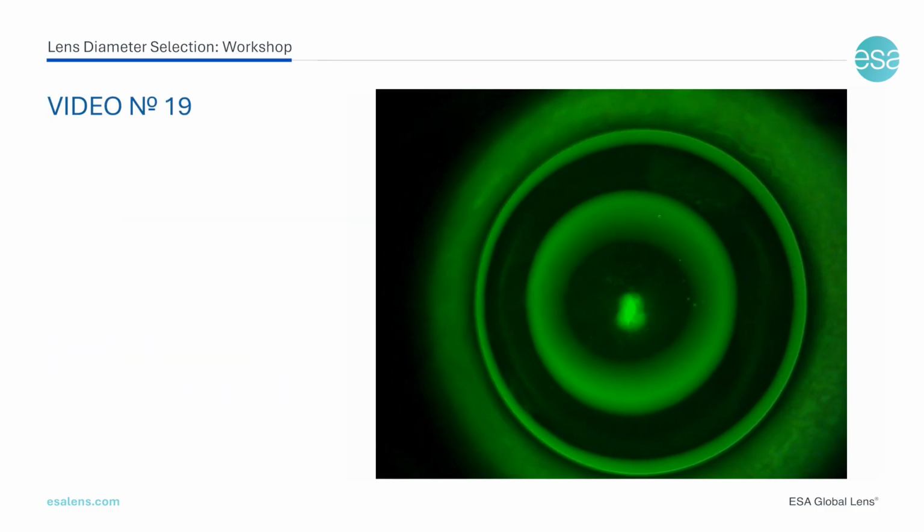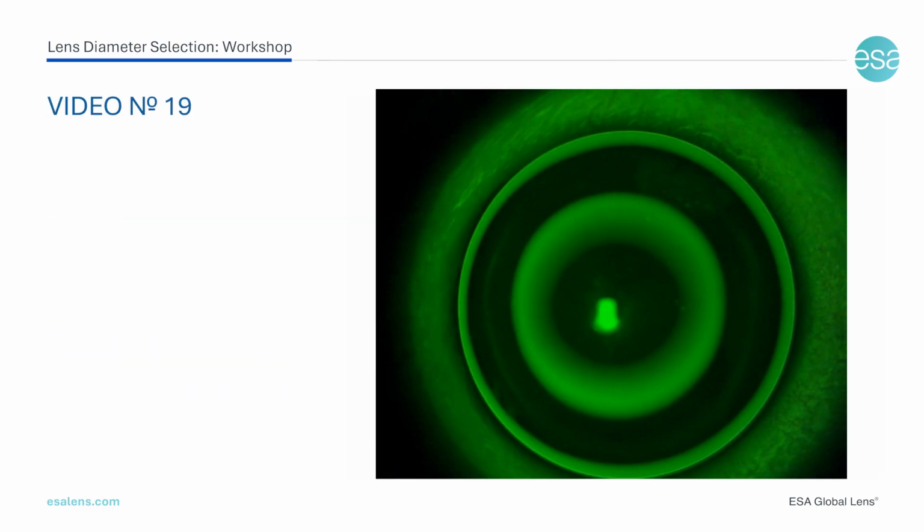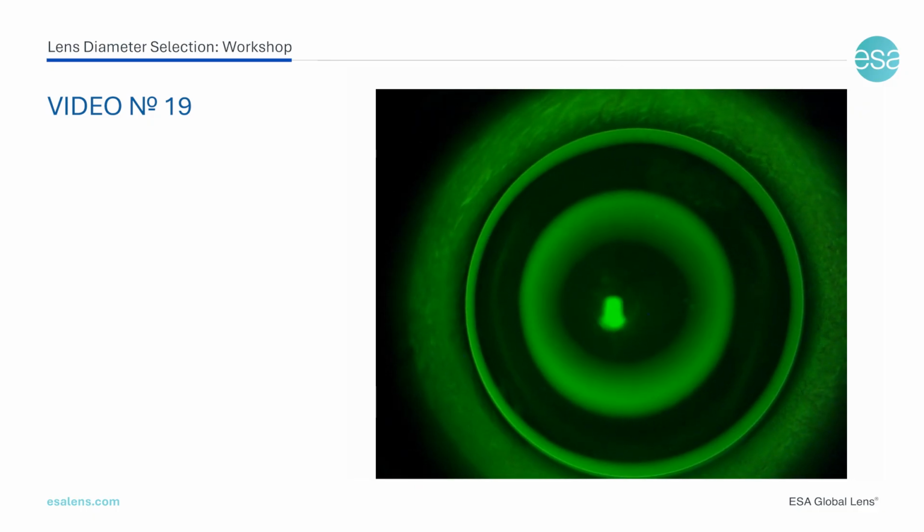The last two videos of the course will be very difficult to analyze. These are for the experts.